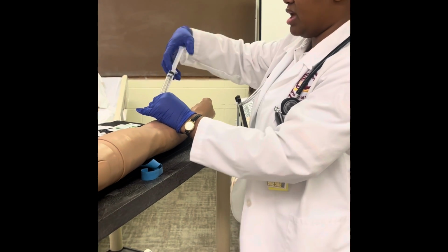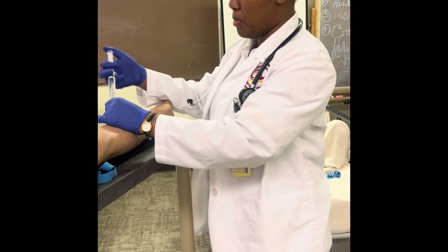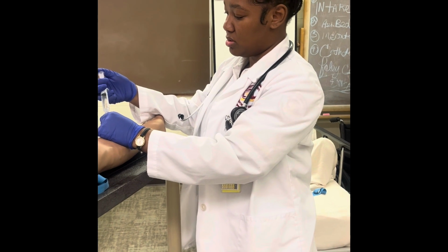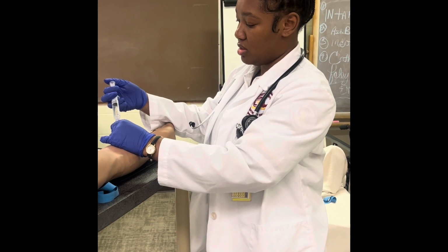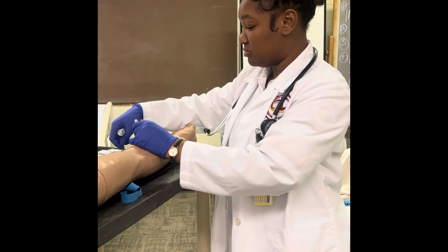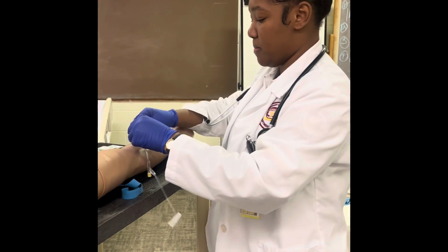And then when I came in here to check the MAR again, I would also make sure I had the right push rate. So go slow, infuse medication at the recommended rate. And then once I'm done infusing all the medication, go in with some more saline to clean out the tubing. And then I can get back up to the pump solution or medication when I'm done.